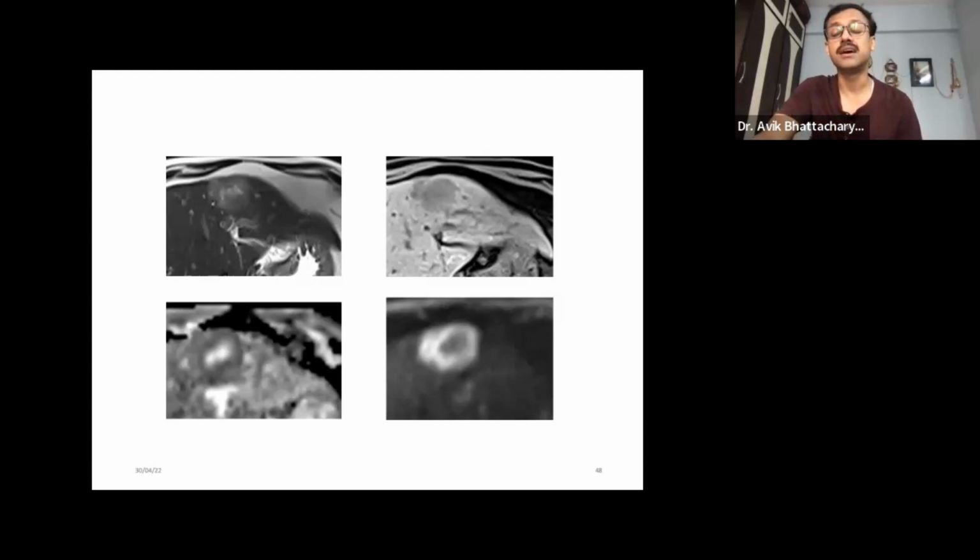And in CE5, there will be peripheral rim-like calcification. So CE4 and 5 are the dead type or inactive variety. CE3 is transient, a transition between the active and inactive stage. CL, CE1 and CE2 are the active stages of hepatic hydatid cyst.